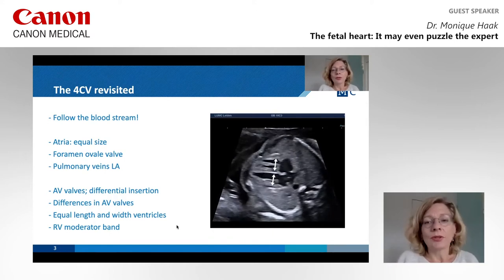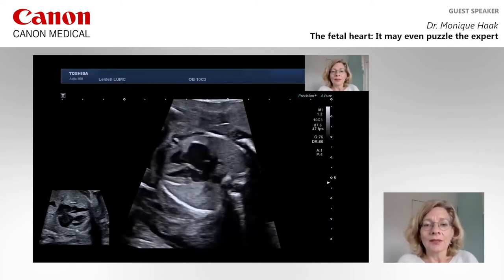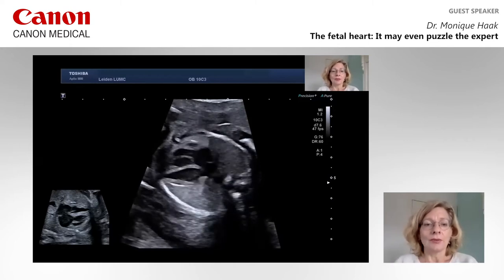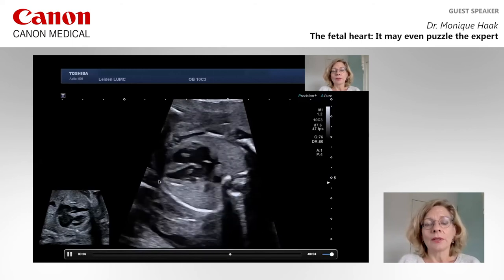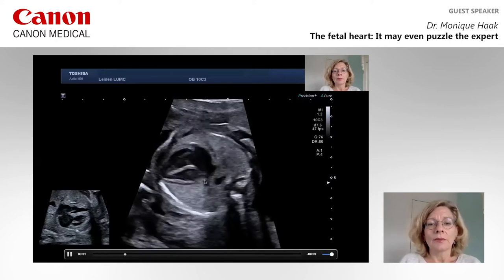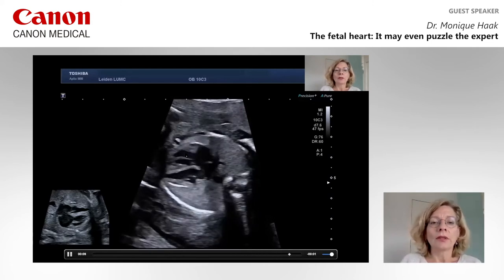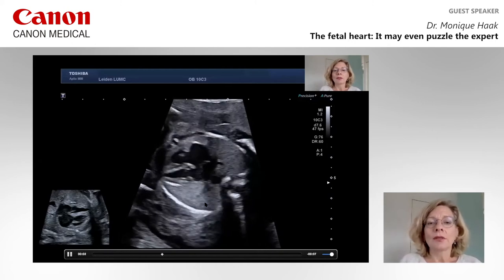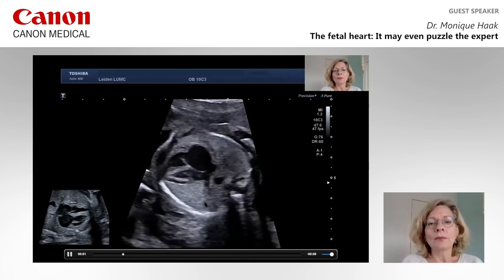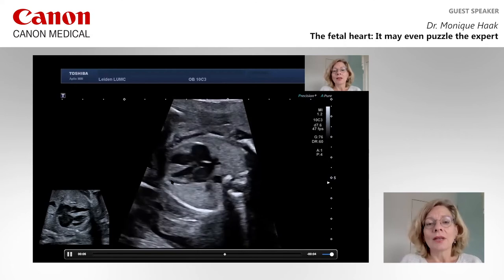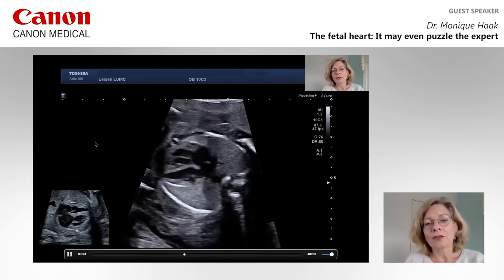Now let's go to our first case. If we assess this four-chamber view as described previously, you will see that we have a problem with symmetry in this heart. The left atrium and left ventricle do not have equal width compared to the right side — the left side of the heart is smaller. This is not hypoplastic left heart syndrome, because this ventricle has enough length and it reaches the apex.